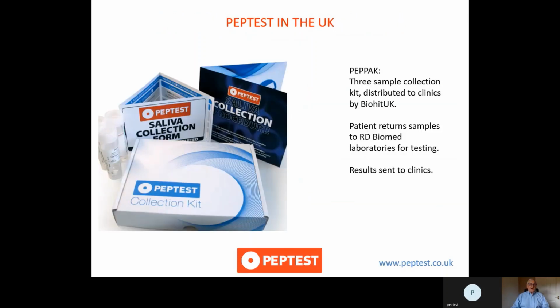In the UK, and in fact in some other countries, but this is basically what happens in the UK, we send patients or provide hospitals with collection kits. The collection kits comprise 3 sample collection tubes, and these are distributed by either us or our distributor, which in the UK is Biohit UK.